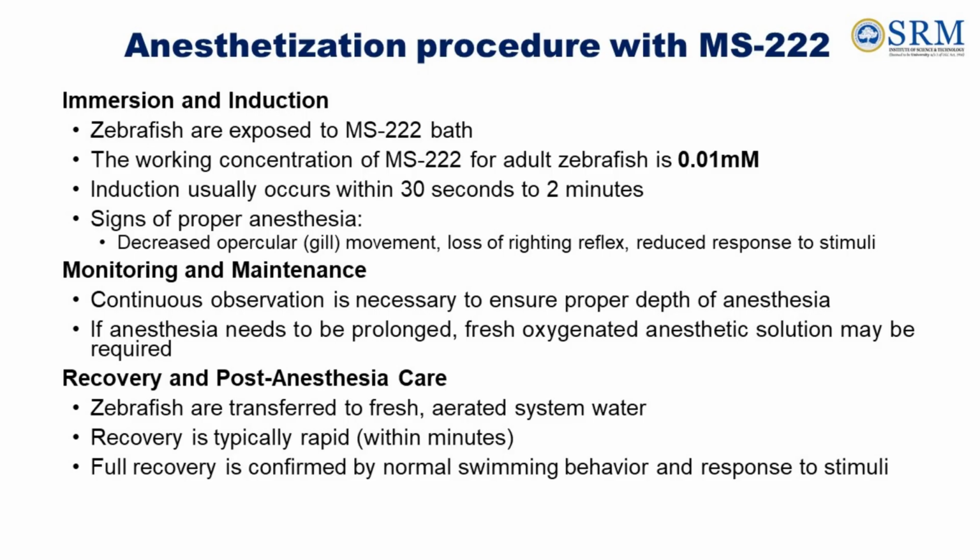Now let us go on to the final step, which is the recovery and post-anesthesia care. Zebrafish are transferred to fresh aerated system water. The recovery for the experimental zebrafish is typically very rapid, within minutes. Full recovery is confirmed by normal swimming behavior and proper response to any external stimuli.